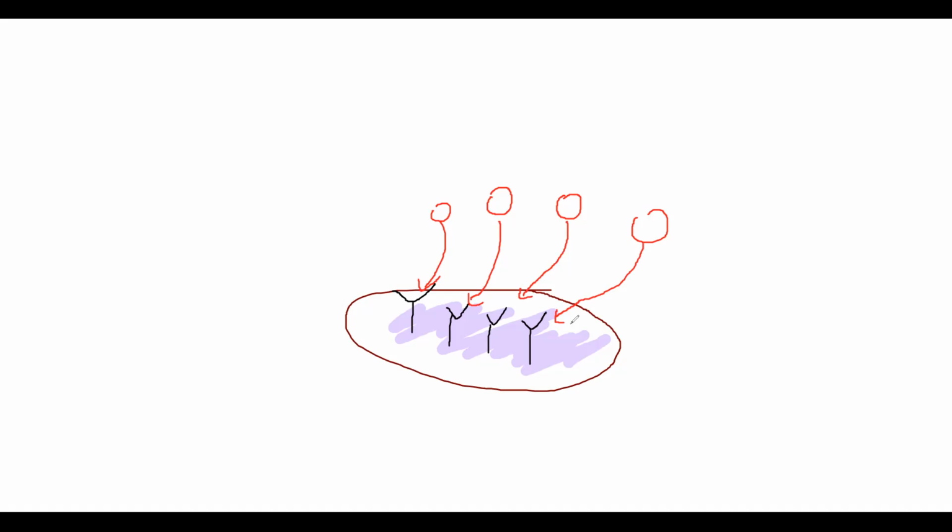Alternatively, you can also do it the other way, wherein you take antigens and add antibodies to them. That will also work. This is also another way. Then we have something called the agglutination test.